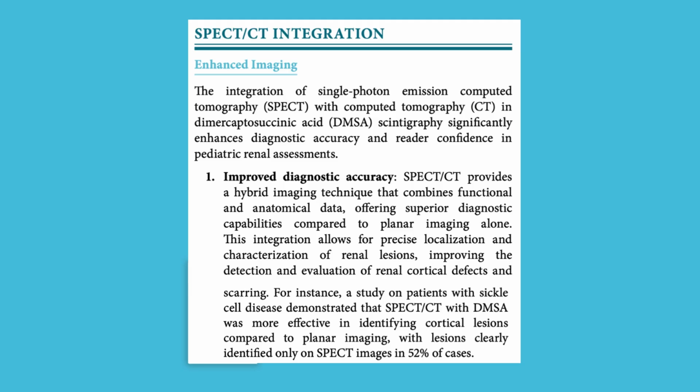SPECT/CT integration. Enhanced imaging. The integration of single-photon emission computed tomography, SPECT, with computed tomography, CT, in dimercaptosuccinic acid, DMSA, scintigraphy significantly enhances diagnostic accuracy and reader confidence in pediatric renal assessments. 1. Improved diagnostic accuracy. SPECT/CT provides a hybrid imaging technique that combines functional and anatomical data, offering superior diagnostic capabilities compared to planar imaging alone. This integration allows for precise localization and characterization of renal lesions, improving the detection and evaluation of renal cortical defects and scarring.